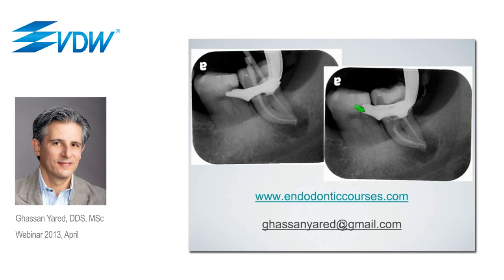So for this case, again, the canal preparation was started with the R25. The R25 was taken to the estimated length minus 4 or 5 millimeters. A hand file was used in the canal. Fortunately for me, I did not have to pre-curve it. It went straight to the working length. I knew then that I could, in this case, use the reciproc to the working length without any issues. And with this, I finish my presentation.